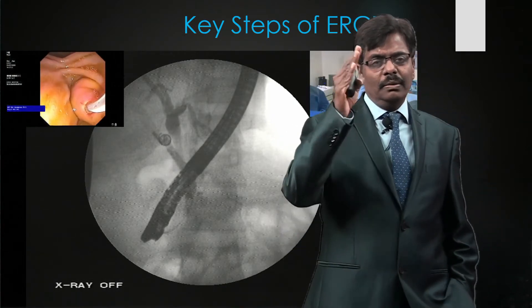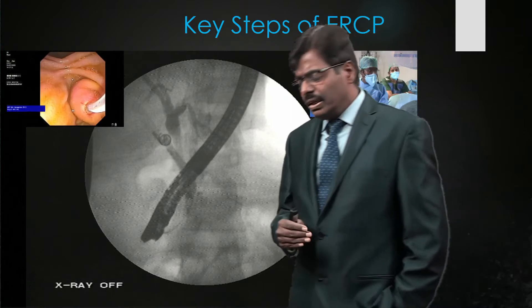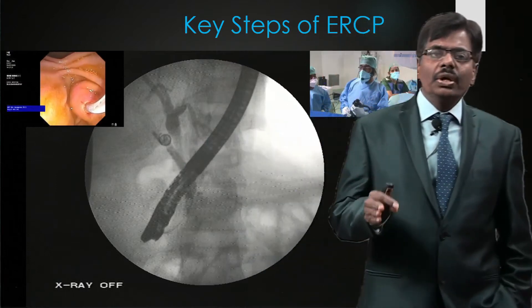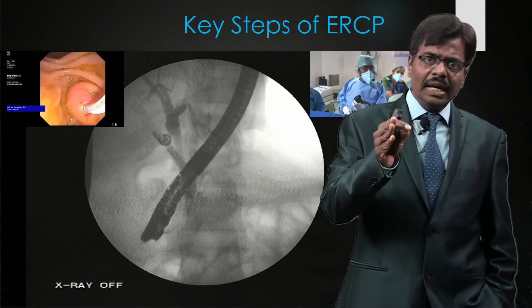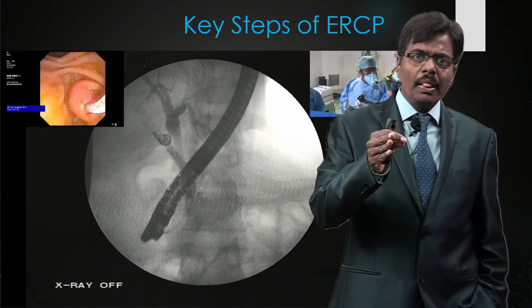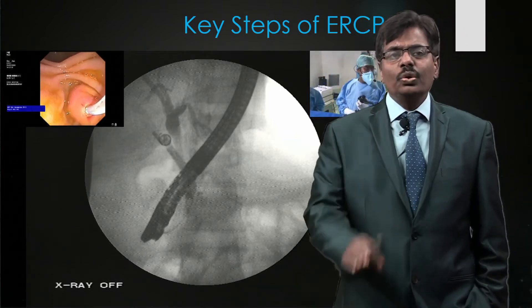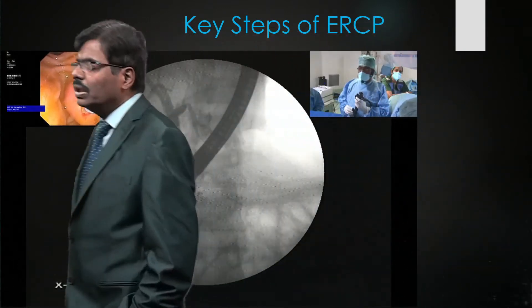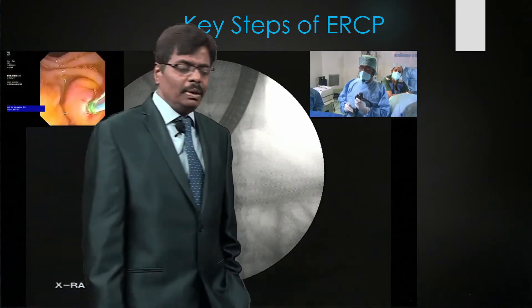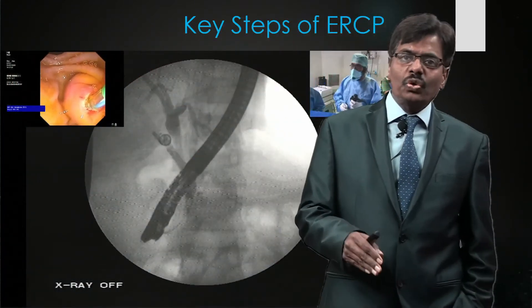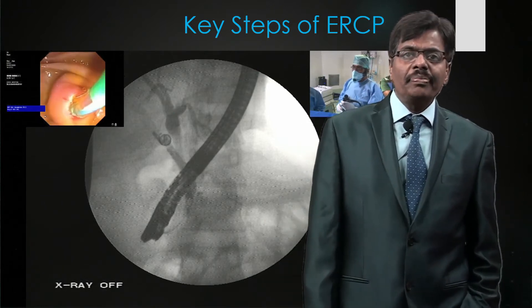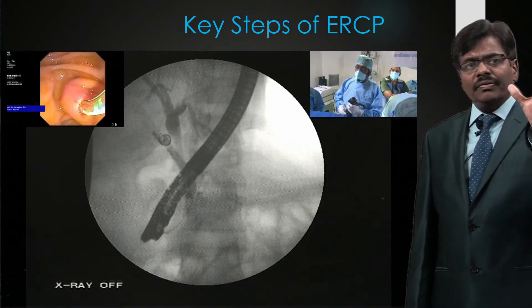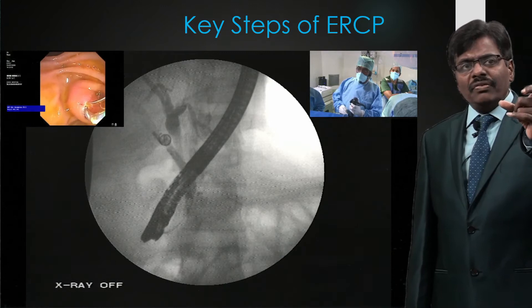To gauge duct size, use your scope as a reference — the therapeutic scope is 10.8 mm. If the duct is slightly smaller than the scope, it is around 9.5 to 10 mm in diameter. There is some degree of magnification, so use the scope diameter as your reference. You can see how I position myself and the view obtained inside as I ask my staff nurse to pull the wire taut.